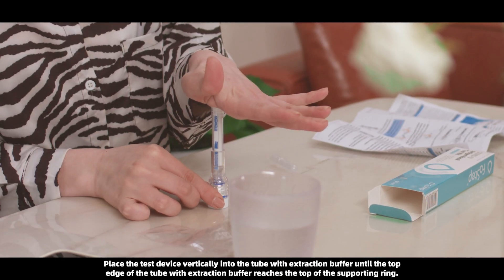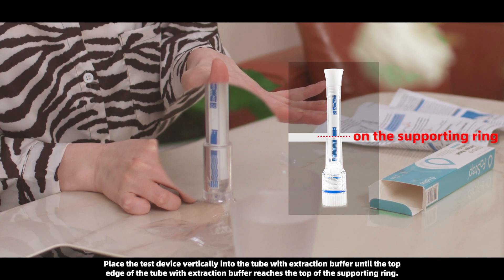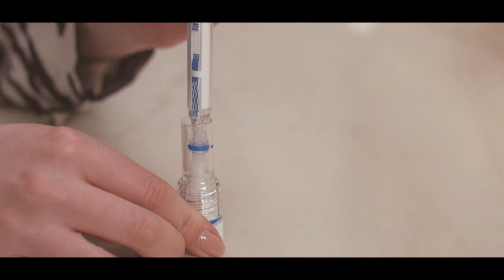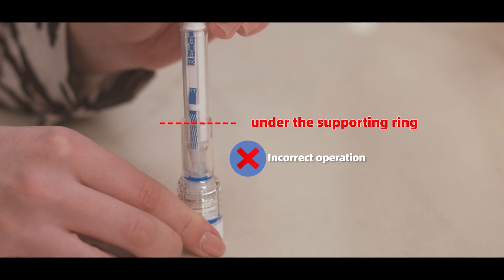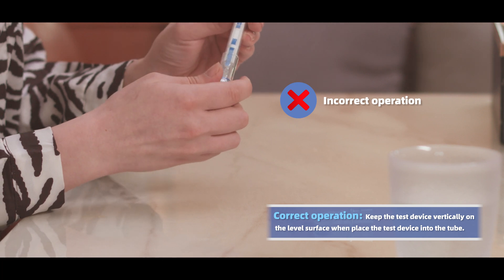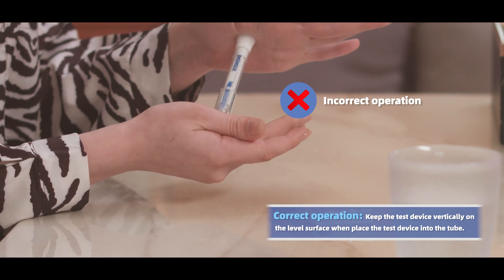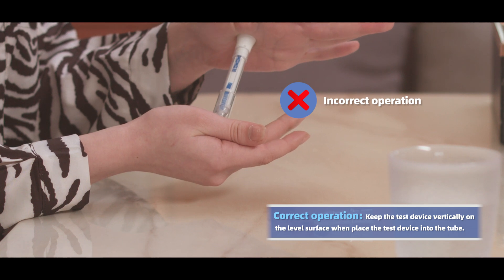Place the test device vertically into the tube with extraction buffer until the top edge of the tube with extraction buffer reaches the top of the supporting ring. Correct operation: keep the test device vertically on the level surface when placing the test device into the tube.